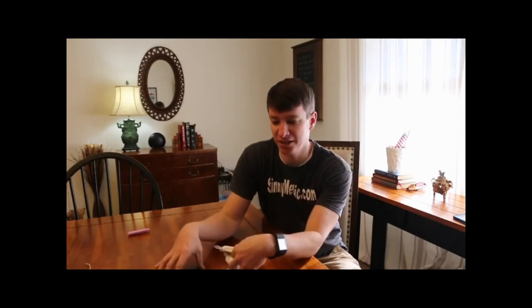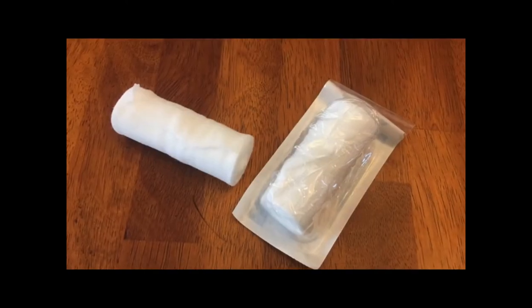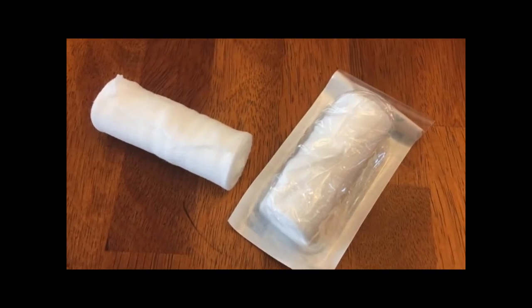So we talked about what the very best was. That's our hemostatic agent here. Let's go down the line just a little bit. This is just a roll of kling, Kerlix, whatever you want to call it. This is basically just cheesecloth here. And then compressed gauze. This is a lot cheaper to buy, a box full of kling or compressed gauze.